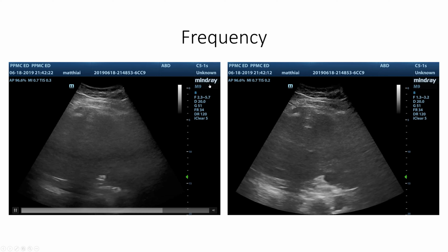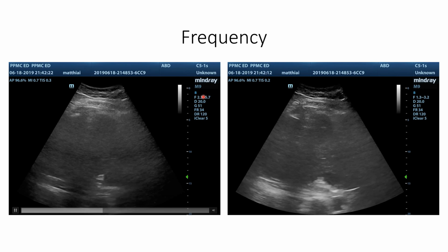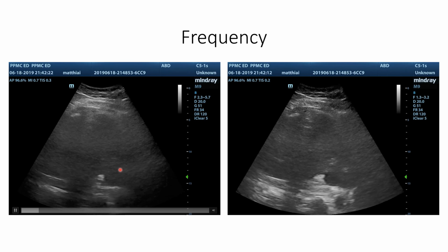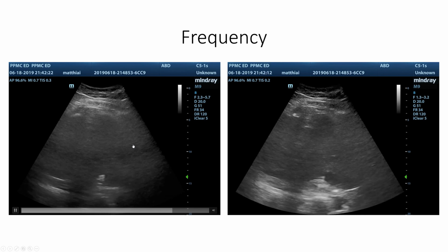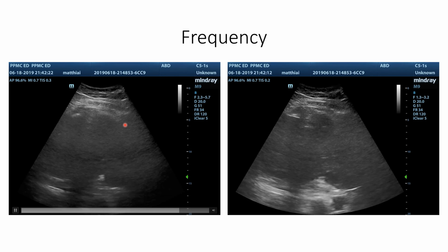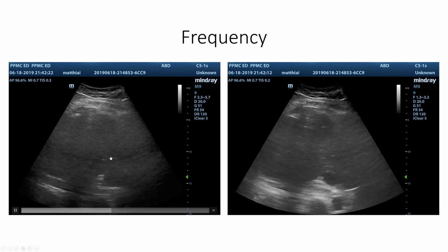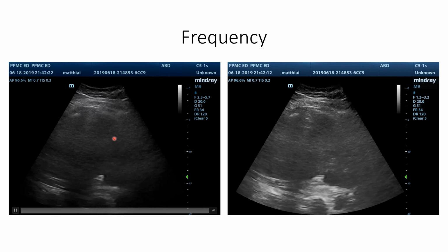And on screen left with this higher frequency, this 2.3 to 5.7 megahertz range, it's pretty difficult to really make a call about the volume status of that IVC, because this is a patient with a decent amount of adipose tissue, but even worse, a really steatotic liver. We're not doing a good job of showing that steatotic liver here, but just trust me, this is a super steatotic liver, really attenuating our sound beams.